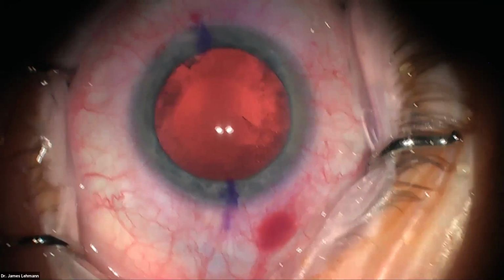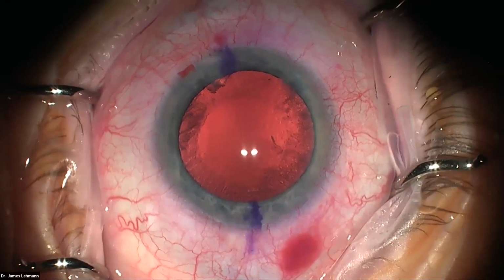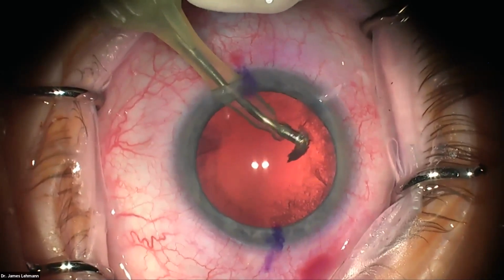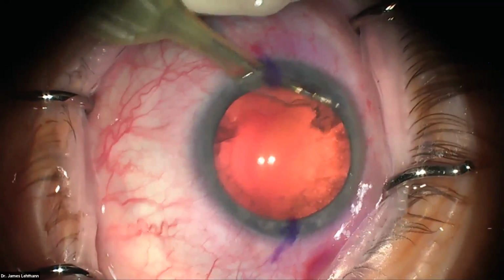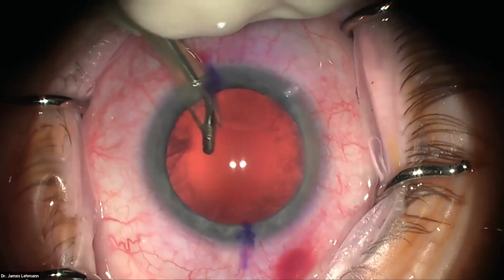All right, so now you see some cortex, but most of it's on the posterior capsule, but we're going to go around the anterior capsule and make sure there's none that we can pull off easily. So that piece, now I'm just eating it. A little trick I like to do is mash it at the base of my paracentesis where I know those endothelial cells aren't happy anymore anyway, without having to stick a second instrument in.